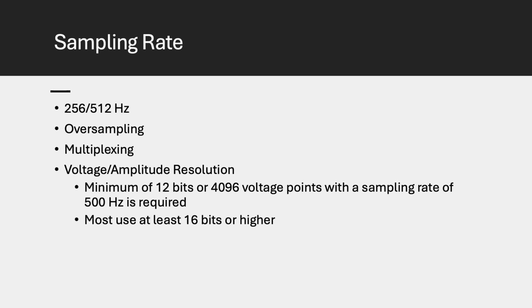Multiplexing is the combination of multiple signals in one stream in order to allow data conversion to be performed by fewer ADC components, analog to digital conversion. Alternatively, multiple independent analog to digital converters may be employed, a dedicated ADC for each channel. With proper design and modern components, adequate signal quality can be achieved with either approach.